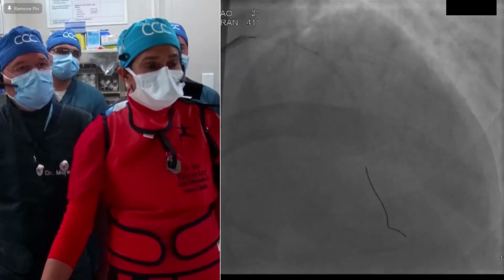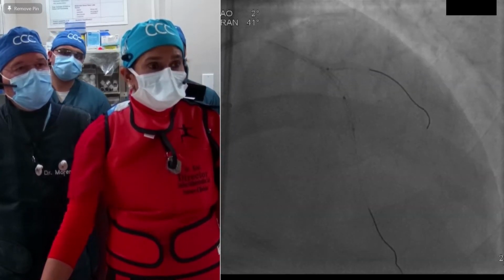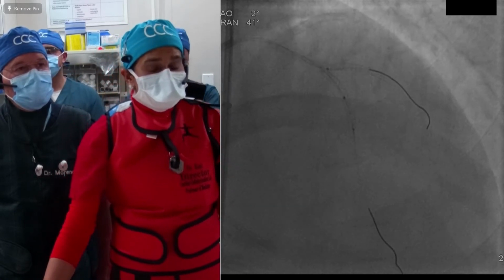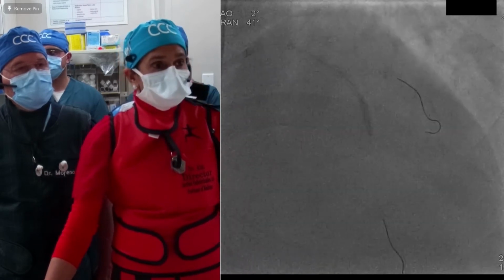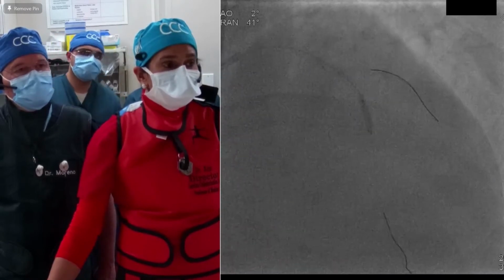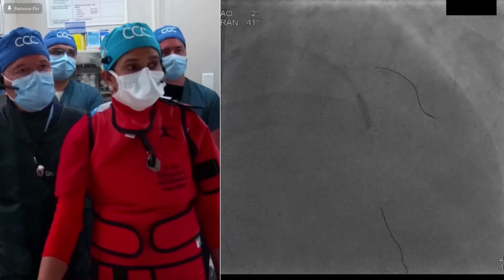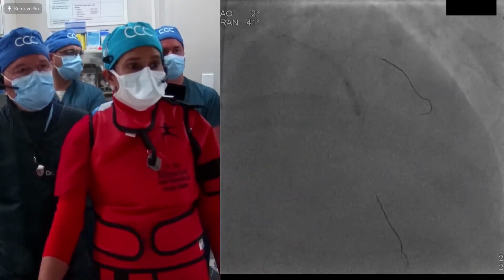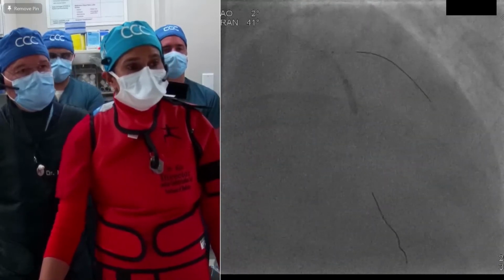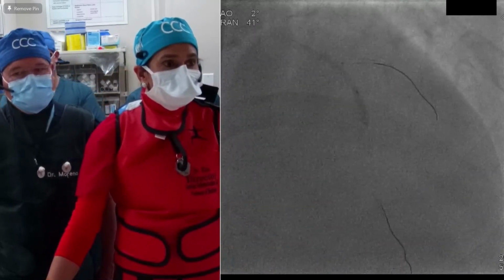Now, we need to recross and kiss. But especially when there is calcium, we do face this problem: even though I was able to wire, no balloon would go into the side branch. So what you do in that case, if you see here what we have saved, is a 1.25 balloon. And what we call this is a balloon anchor technique. You go 1-to-1 balloon size to the LAD or the main vessel distal to the side branch, go high, about 10, 12 atmospheres, and then you get into the side branch. You see, this is the fluorosave.